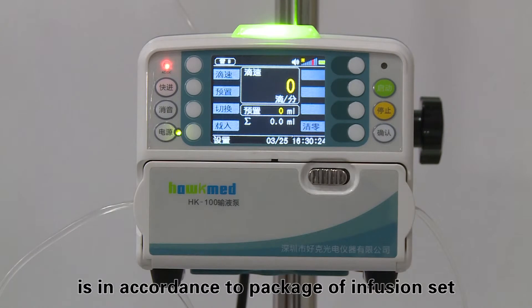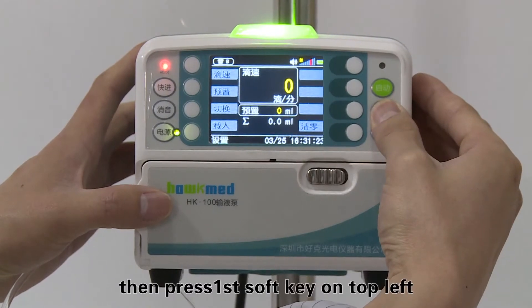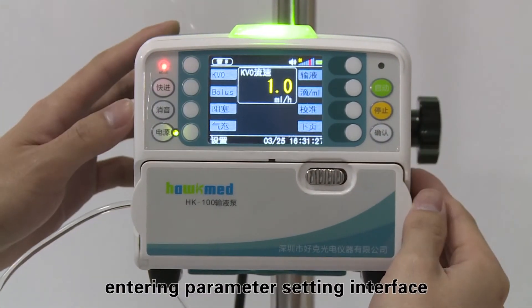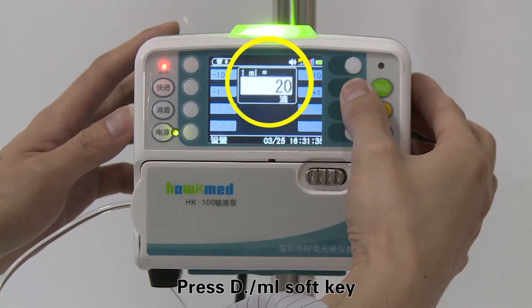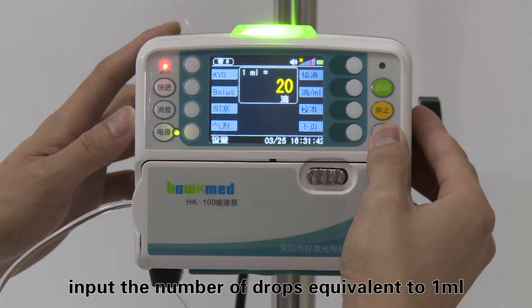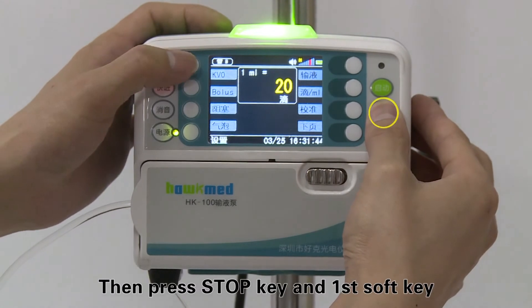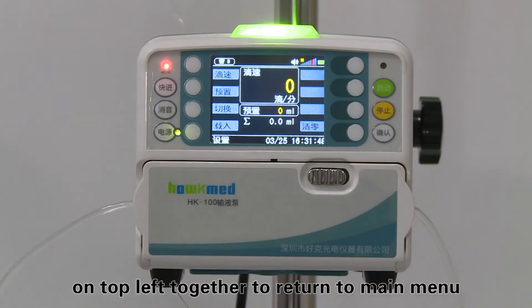The number of drops per milliliter is in accordance with the infusion set packaging. Press and hold the stop key first, then press the first soft key on the top left to enter the parameter setting interface. Press the D/mL soft key and input the number of drops equivalent to one milliliter. Press the enter key to save, then press the stop key and first soft key together to return to the main menu.